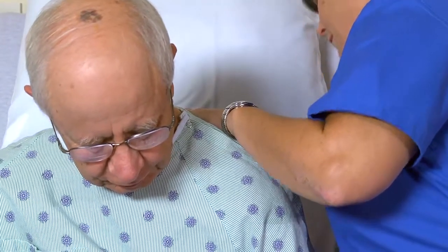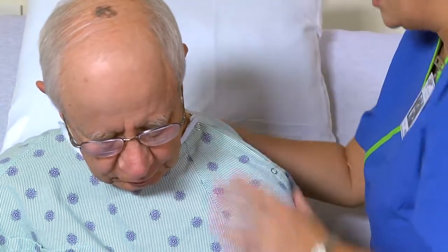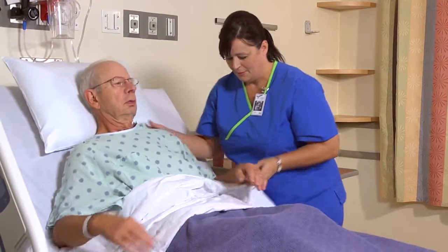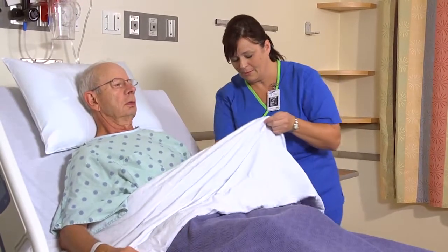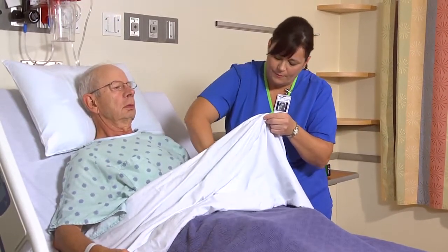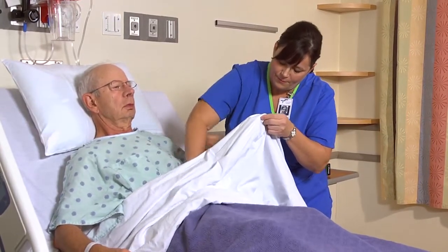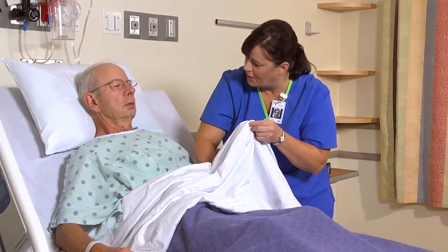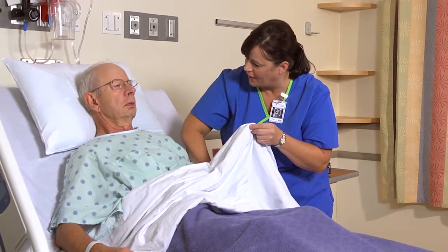If necessary, pad the patient's skin and any bony prominences that will be covered by the restraint. Are you having any tenderness or pain in this area?